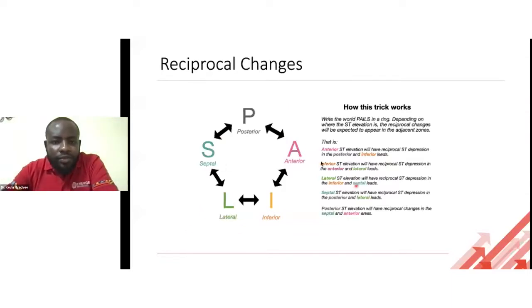So finally, in addition to this, remember there is what we call NSTEMI, non-ST elevation myocardial infarction. Your patient might have very normal ECGs, they have chest pain. If you have the luxury, if your lab is able to do troponin, high sensitivity troponins, they come back elevated, it's still an MI. The fact that your ECG doesn't meet criteria for myocardial infarction doesn't mean it's not an MI. If your patient ticks all the boxes for an MI, or the risk factors, despite the ECG, always do a troponin. It's always a good idea to get the correct diagnosis.